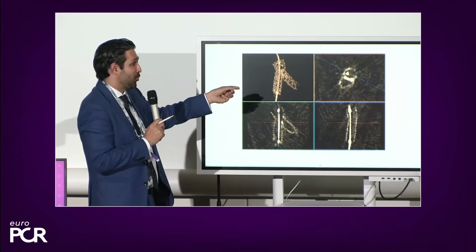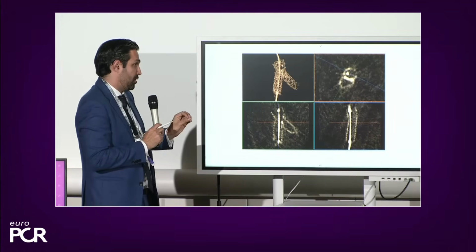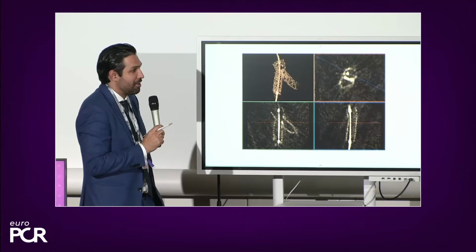And of course, if you do a two-stent technique, we have Dean on the panel, you can even assess both branches in terms of stent expansion. And I think this is a big potential use of this technology. I don't know what your thoughts are, Dean, when you see this picture.